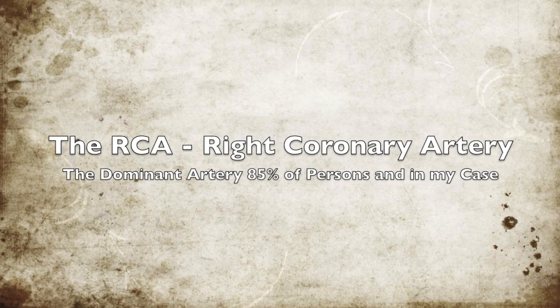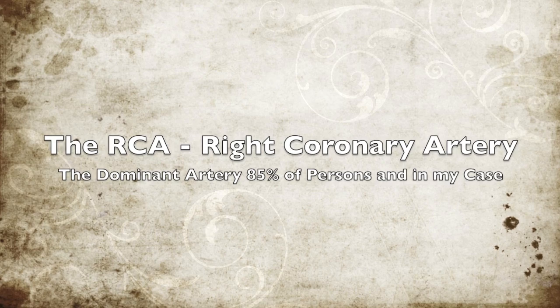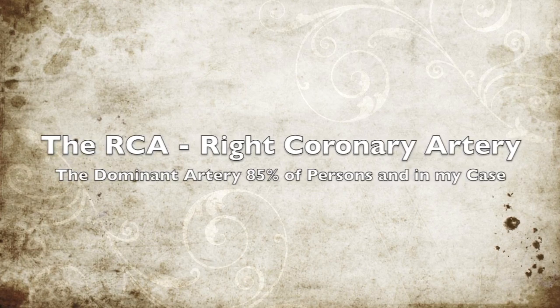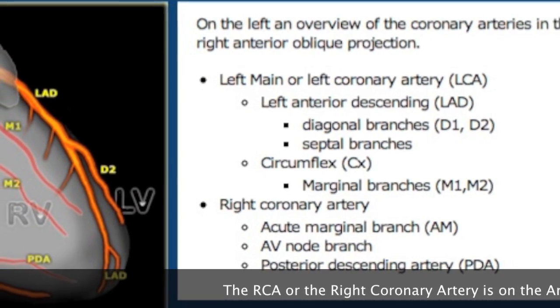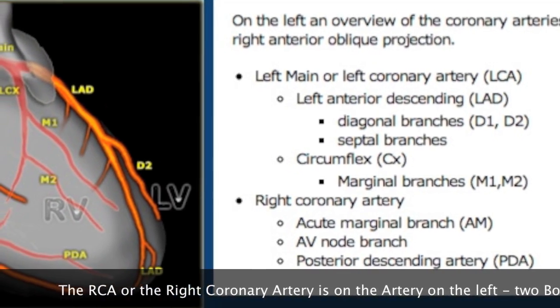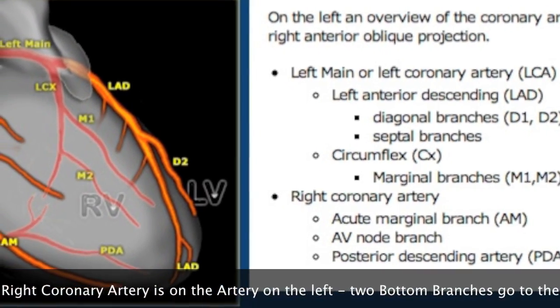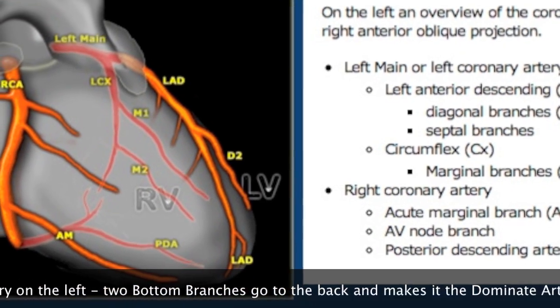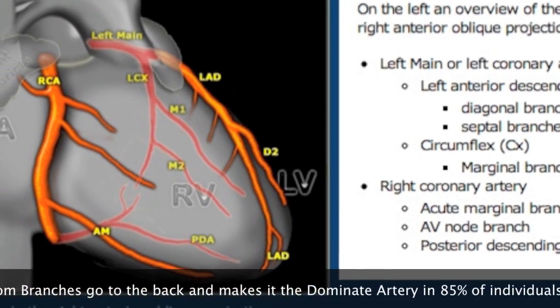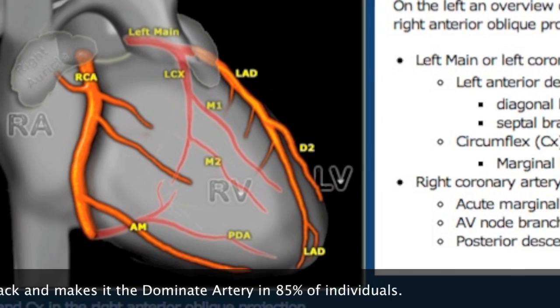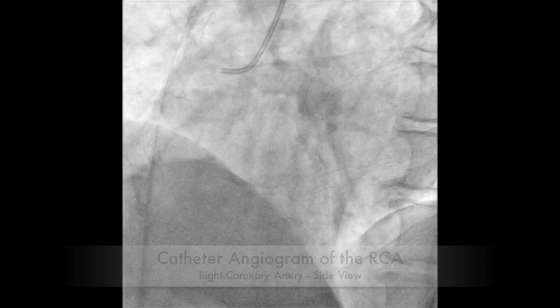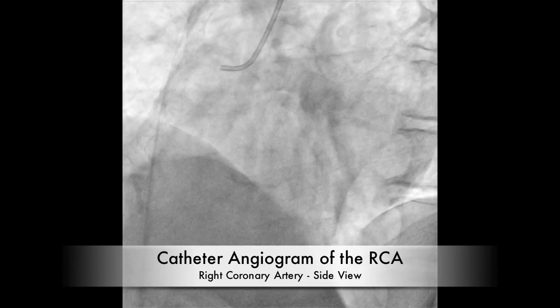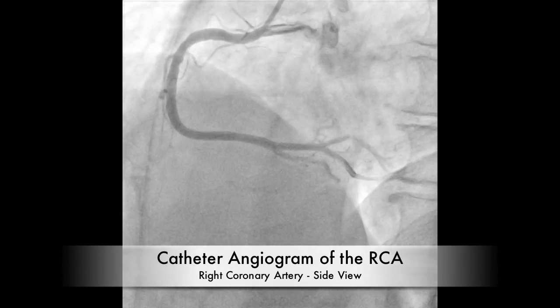Now we're going to look at the right coronary artery. The RCA is dominant in 85% of people in the world. The RCA is the artery on the left, and we see it has two branches that go back — that's what makes it the dominant artery in 85% of individuals. In the image you can see a PDA and an AM.